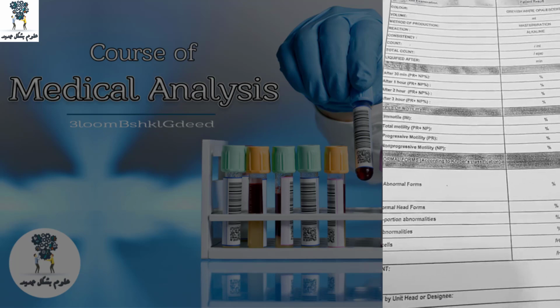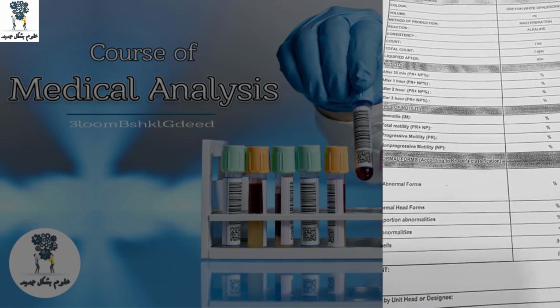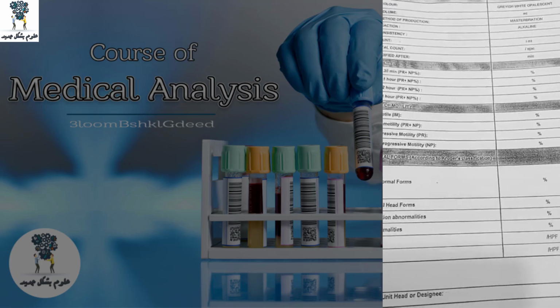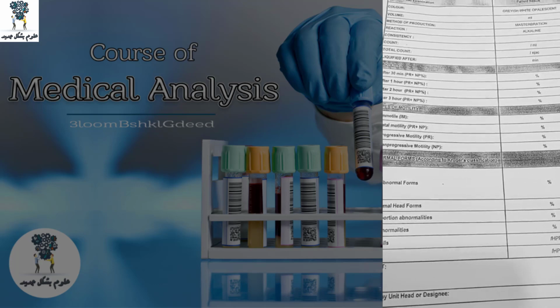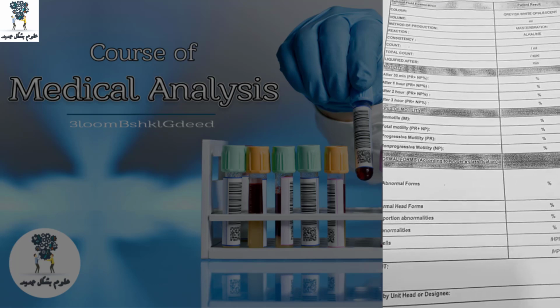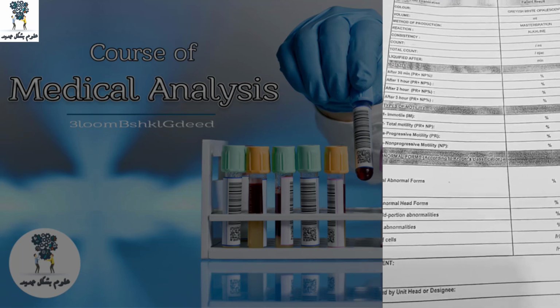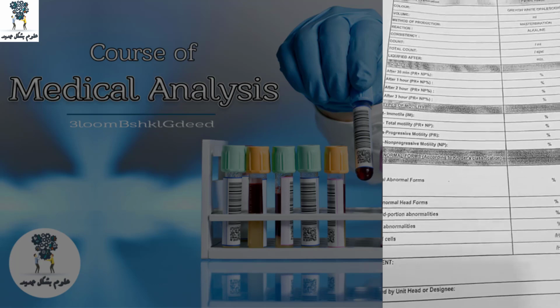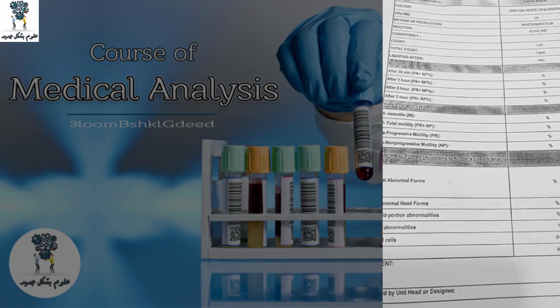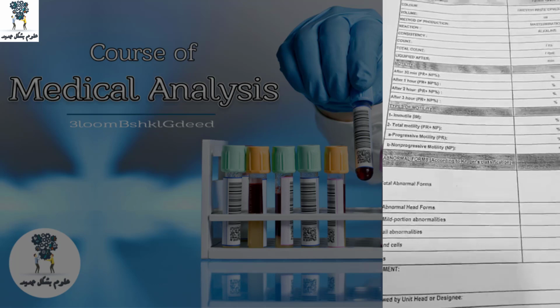طيب لو أنا لقيت الحجم بتاعي أقل من 1.5، أنا في الحالتين يا إما بكتب للدكتور إن العينة 1.5 فوليوم ده هايبوسبيرميا، أو أرجع أقول للدكتور أو للبيشنت نفسه إني مش هاكسبت العينة أقل من 1.5، لأن أنا كده مش هعرف أكمل شغل العينة. فده في وجهة المعمل والكواليتي بتاعه المعمل at first.